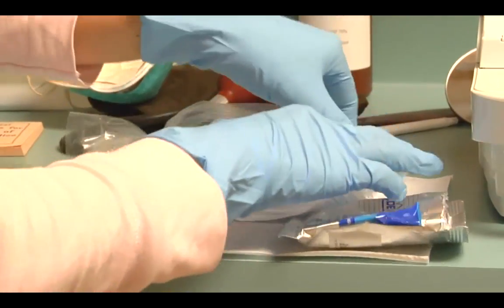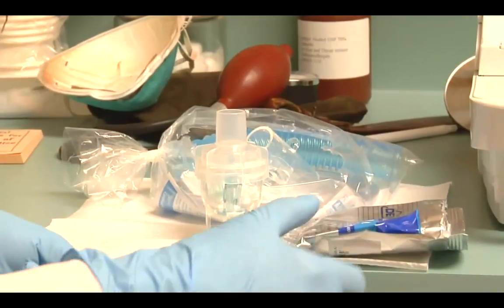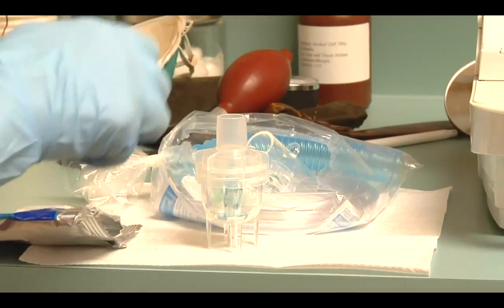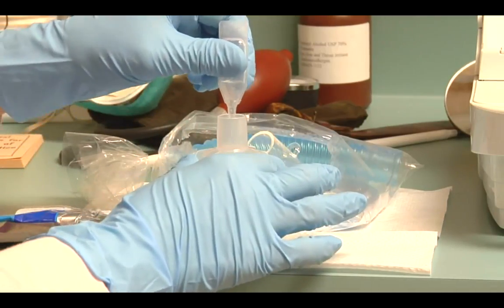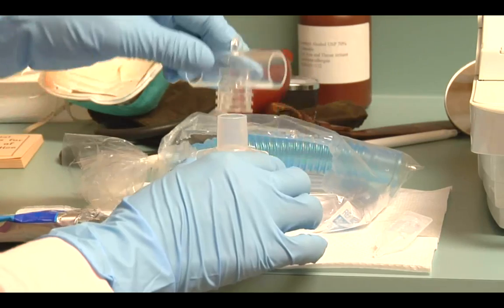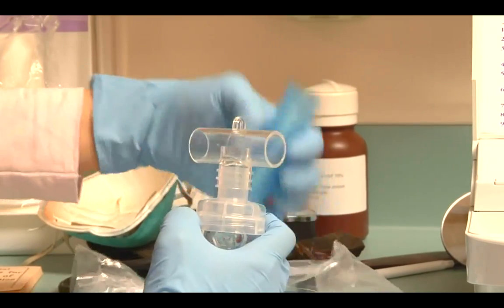We're going to go ahead and take out the chamber. We're going to take our medication and put it directly into the chamber. We're now assembling the T-piece, and we're going to assemble the mouthpiece.